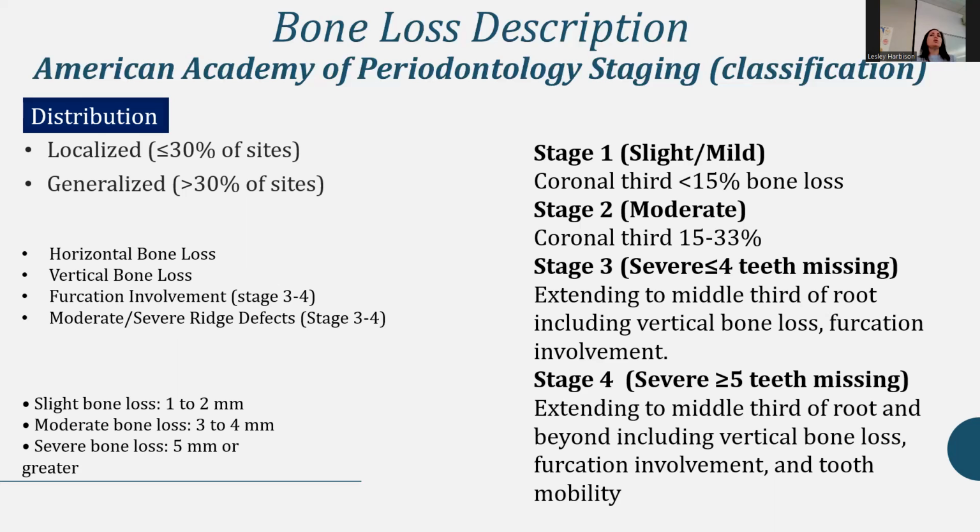So when they ask you, is this generalized or localized? It's the same thing with gingivitis too. You basically count up the areas. Is it more or less than 30% of all the teeth that they have in their mouth? So that's distribution.